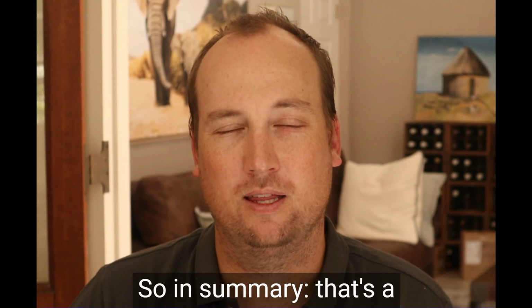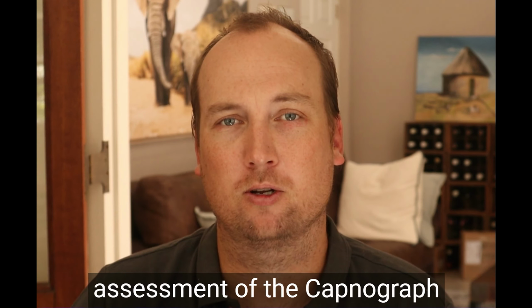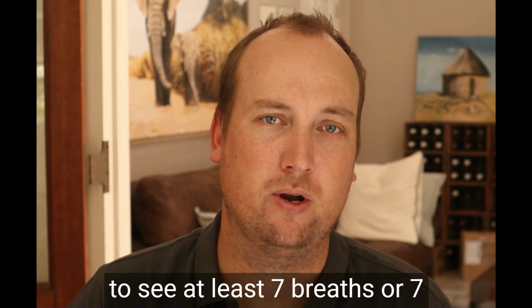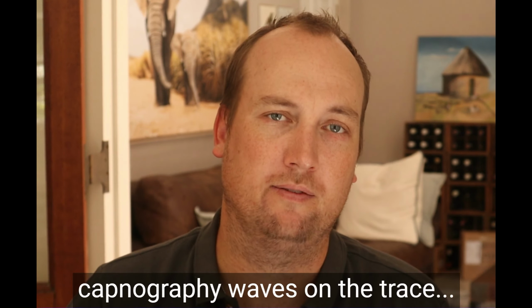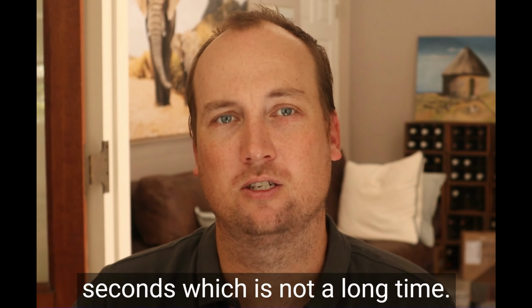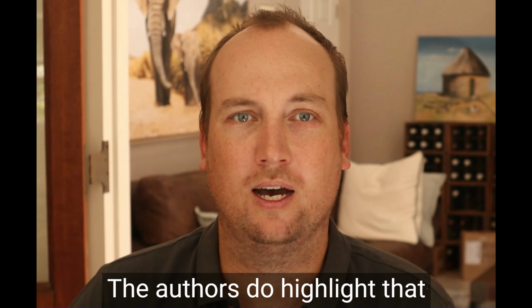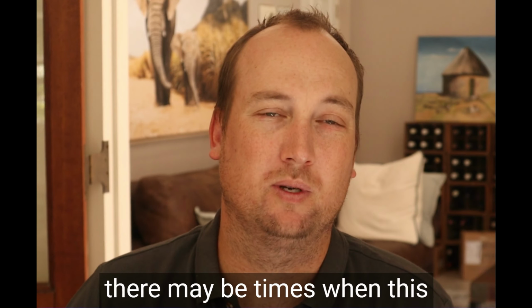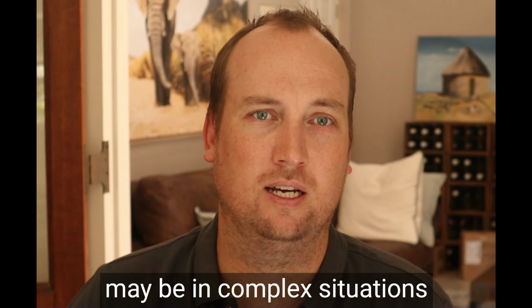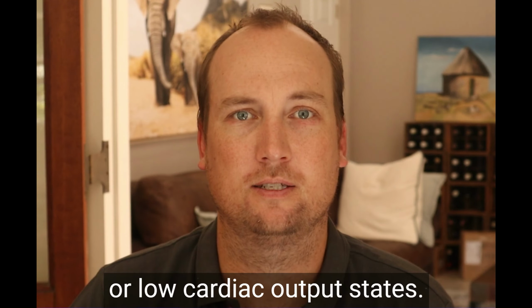So in summary, that's a timeout and a two-person assessment of the capnograph waveform, where one waits to see at least 7 breaths or 7 capnography waves on the trace. And this should take probably 30 seconds, which is not a long time. The authors do highlight that there may be times when this test is less reliable, and this may be in complex situations such as mediastinal tumors or low cardiac output states.